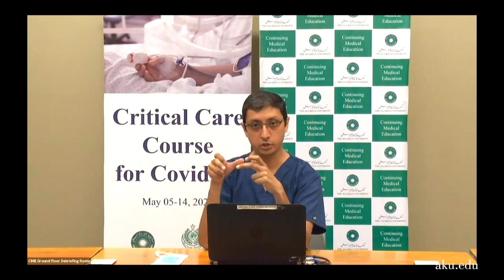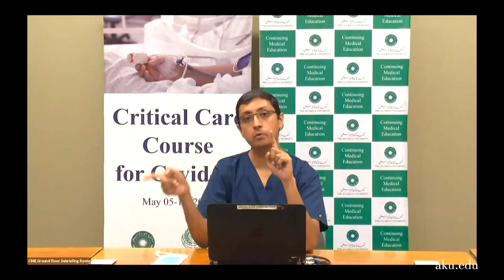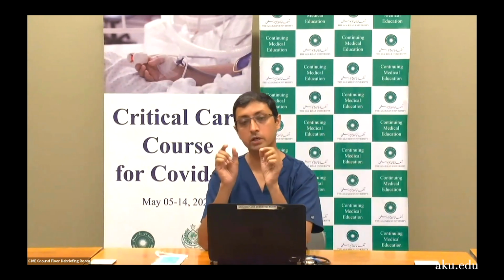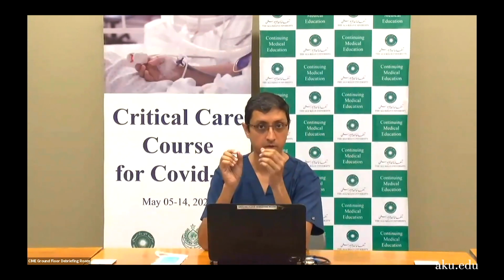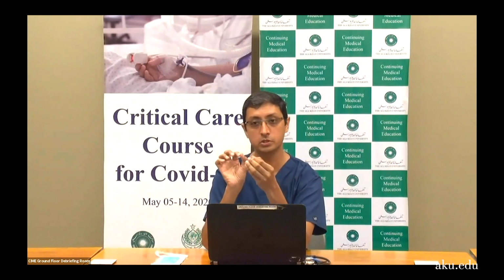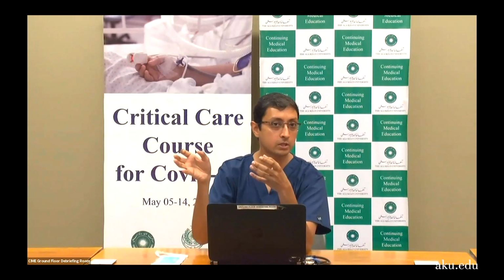With the pressure, the tidal volume will vary with the compliance, but the airway pressure will not change. It will keep on delivering the air till it reaches a peak inspiratory pressure of, let's say, 15 or whatever you have dialed up. You dialed up 15, it will come up to 15. Now in reaching that 15, it delivered 300 ml in one breath, 350 in another breath.